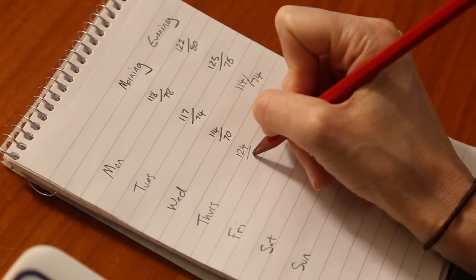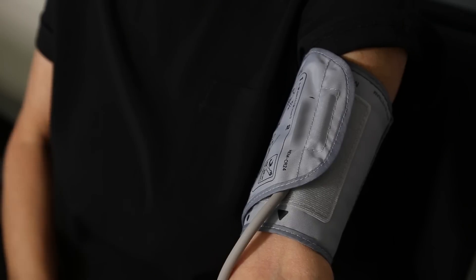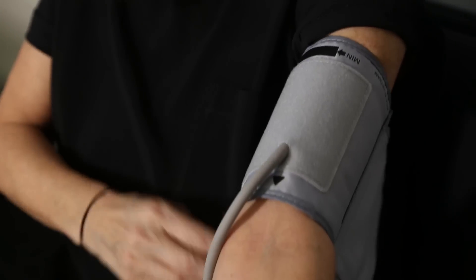Write your measurements down with the date and the time. Wait a couple of minutes and take another measurement. If you find there's a big difference, wait a few more minutes and do it again.